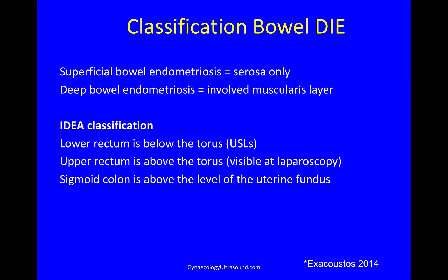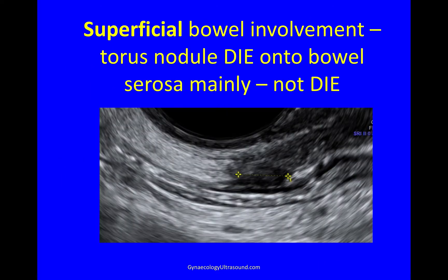The classification for bowel DIE is that superficial bowel endometriosis affecting the serosa only is not DIE. To have DIE you need to have an involved muscularis layer. The lower rectum is below the torus, the upper rectum is above the torus and is visible at laparoscopy, and the sigmoid is above the level of the uterine fundus. Here you can see the dark muscularis layer and a very superficial nodule of endometriosis that has not made the muscularis layer thick — so it's not DIE.